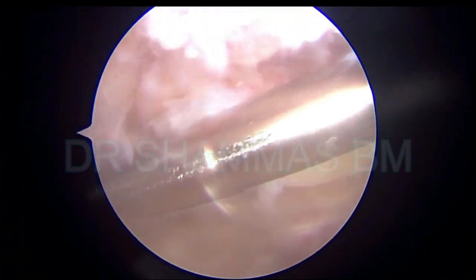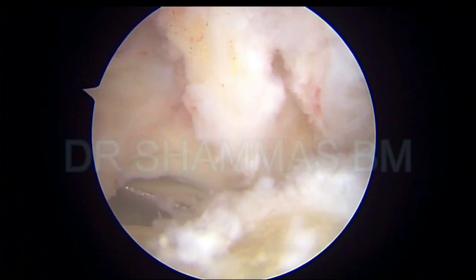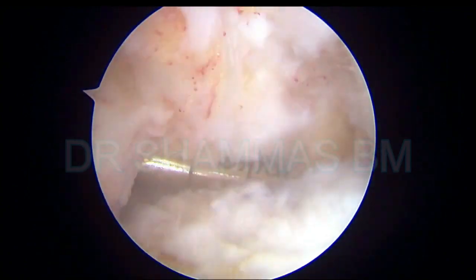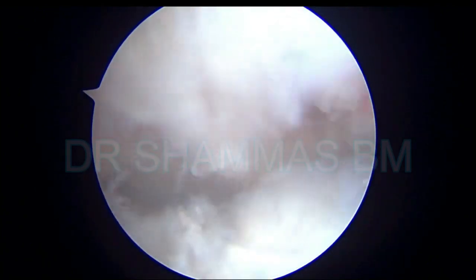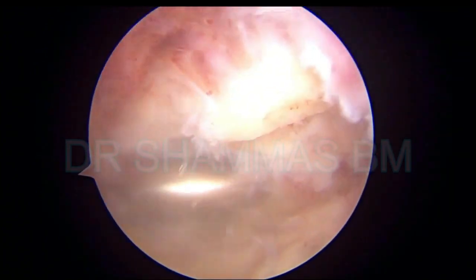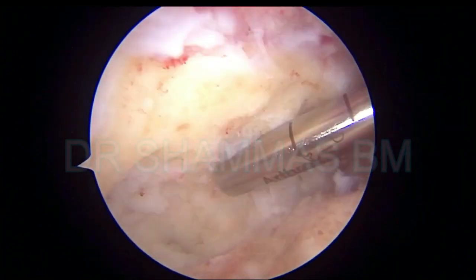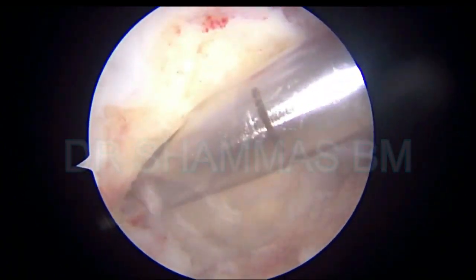Now I am on the tibial side removing the soft tissues from the tibial side in the posterior aspect. Since this is a chronic case with multiple surgeries, you have a lot to remove. You remove some of the tissue and feel that it is all gone, but when you look again there will be more tissue there. So keep on removing all the soft tissues. Again working in the posterior aspect with the burr on the tibial side — the shaver is being used and all the soft tissues are removed, including the small patches left behind after burring.